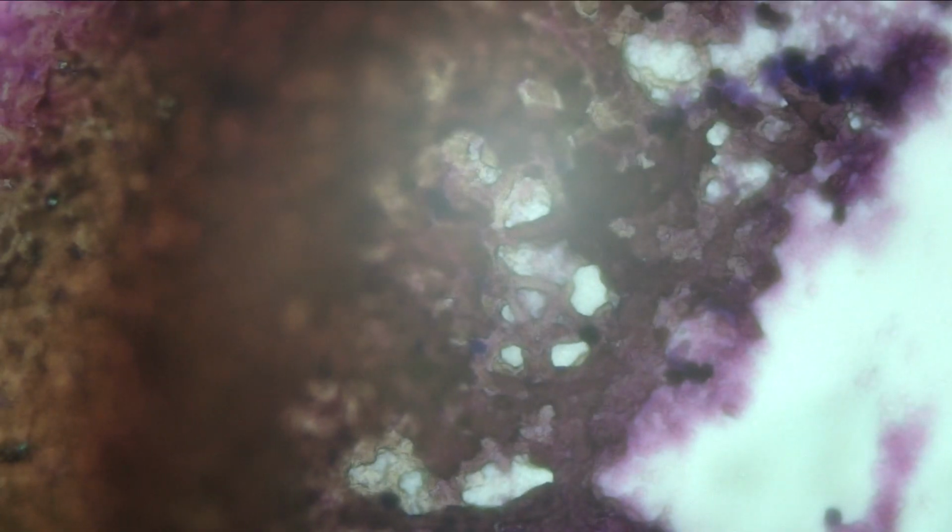So, and if it's a solid pseudopapillary tumor, it's like grapes, ठीक है? You see a lot of branches, and then there are grapes around. Dr. Hassan, what do you see in a solid pseudopapillary? Sorry, we didn't hear you there. Solid pseudopapillaries are like, the best example would be like a branch with the grapes on it.